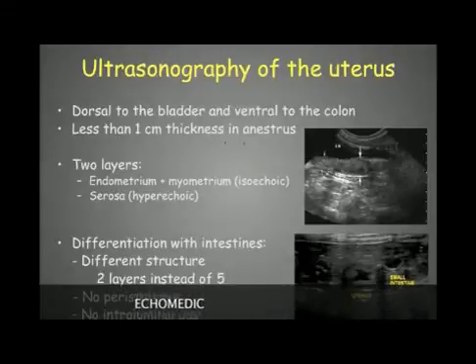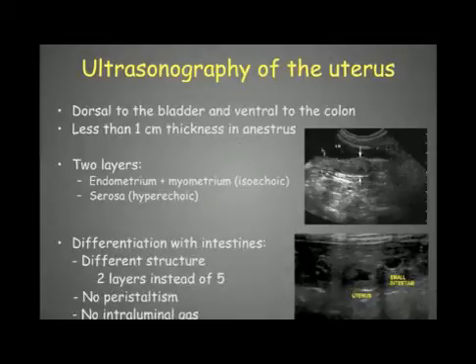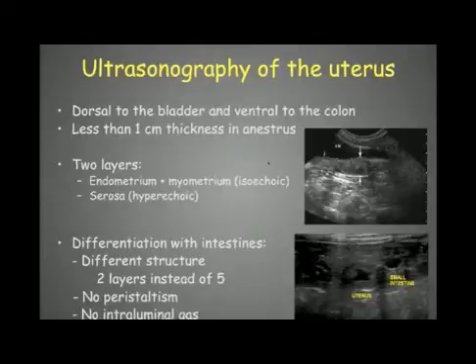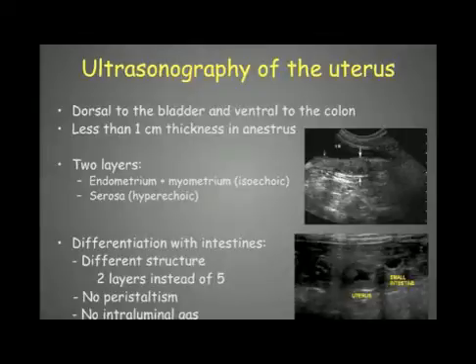The uterus is generally less than 1 cm in thickness at the level of the body during the anestrus period. It is composed of mostly two layers: the endometrium and myometrium, which are isoechoic, and the serosa, which is hyperechoic. Here we can see the hyperechoic serosa and the isoechoic endometrium and myometrium.